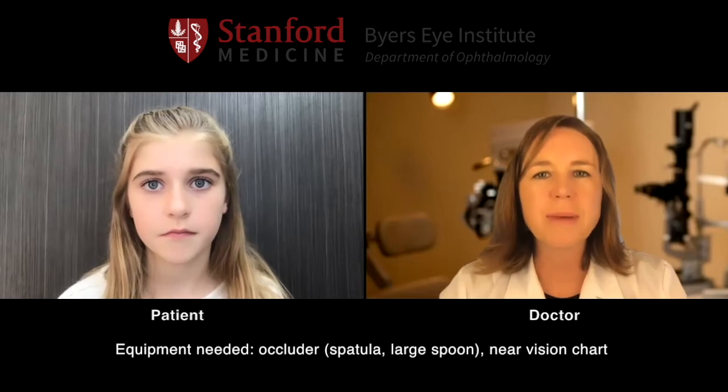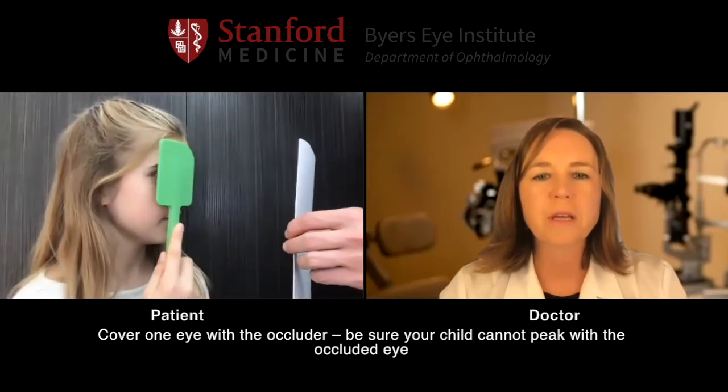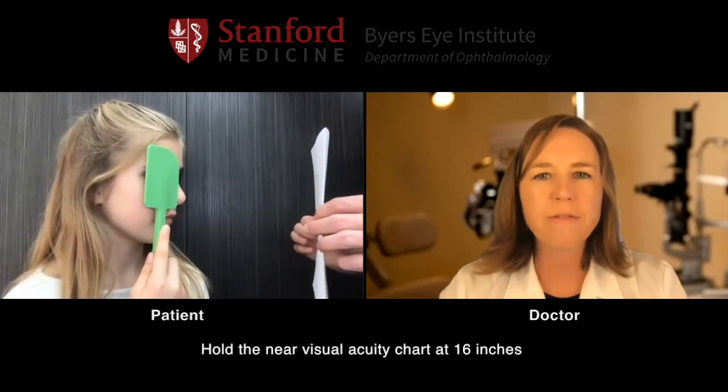And now we're going to go ahead and measure your near vision. We'll start with measuring your left eye. If you can take your green spatula and cover your right eye and turn towards mom to look at that near vision chart. Good. And go ahead and hold that chart at about 16 inches away from the eye.